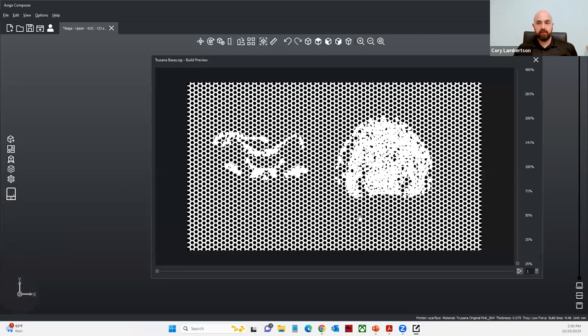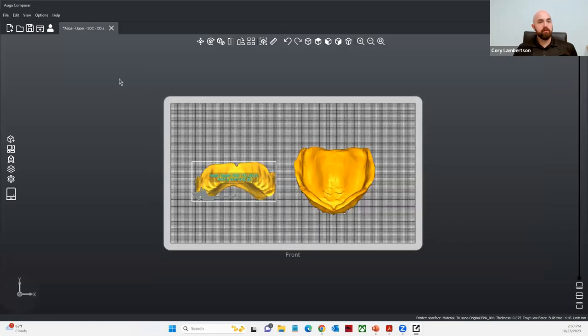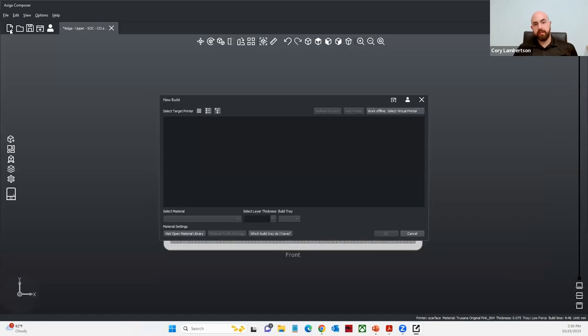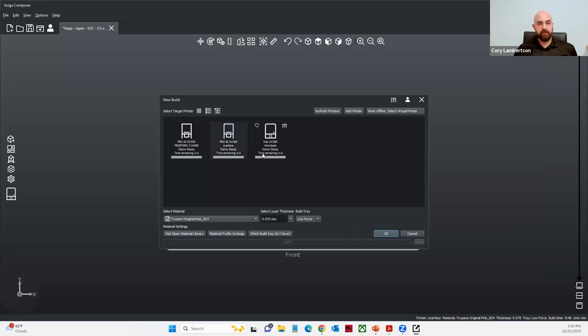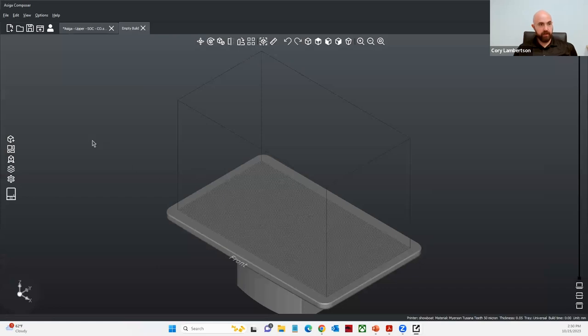I always want to view the slices. We're going to look at slice number one — I can view that I have my base plate. If I press play, it'll go through the slices for me. From here, let's go ahead and set up the job for the denture teeth. The denture teeth is going to follow a very similar pattern — I'm going to choose my Asiga Max, find the Trusana Meyerson Tooth Resin, set it to 50 microns, and simply select OK.